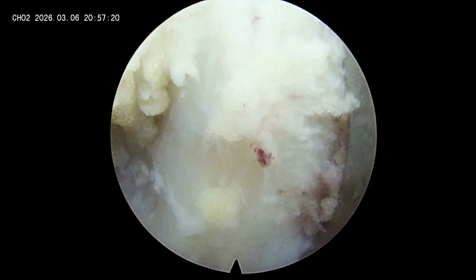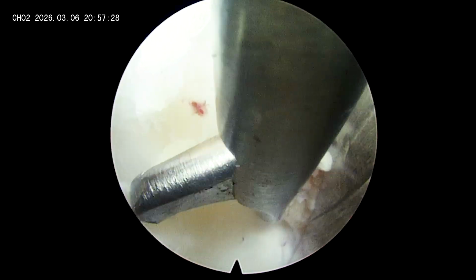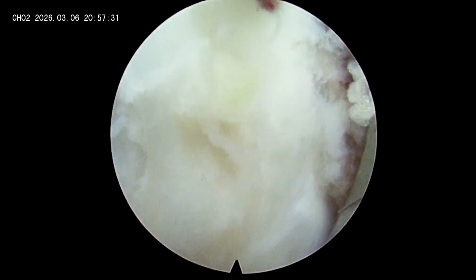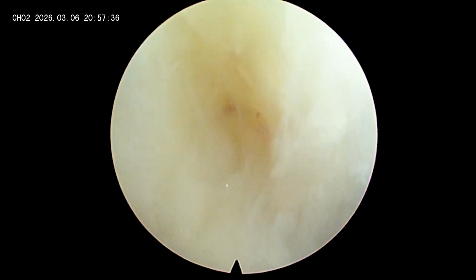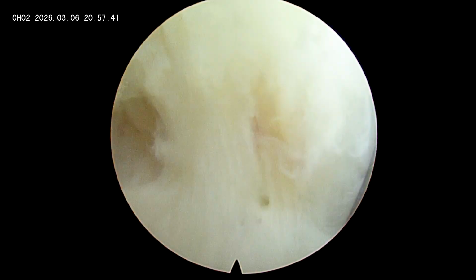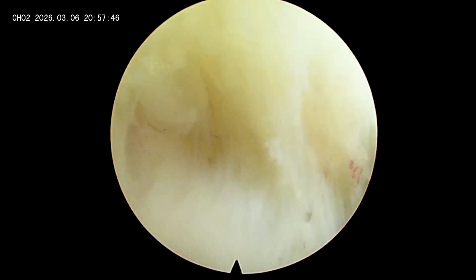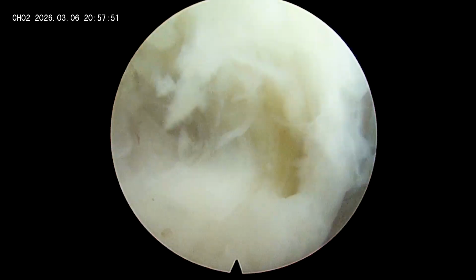Now I am going to use the annular cutter, which is again a very sharp instrument, and I am going to start the flavotomy here. So remember, it is very important to keep the tip of this sharp instrument always under vision. So what I am doing here, I am just using the rotatory movement to cut the ligamentum flavum layer by layer. At the same time, I have rotated the camera so that the tip of this instrument remains in my vision.